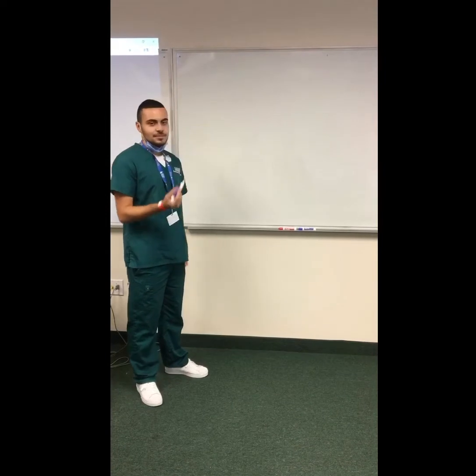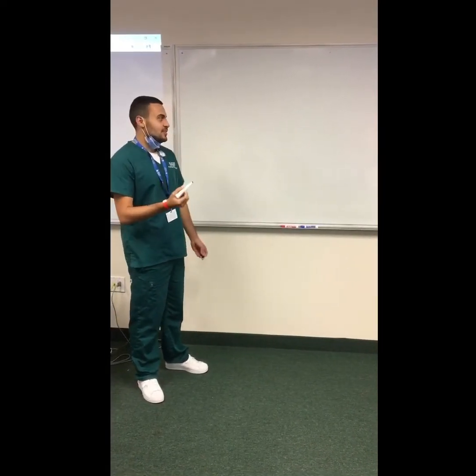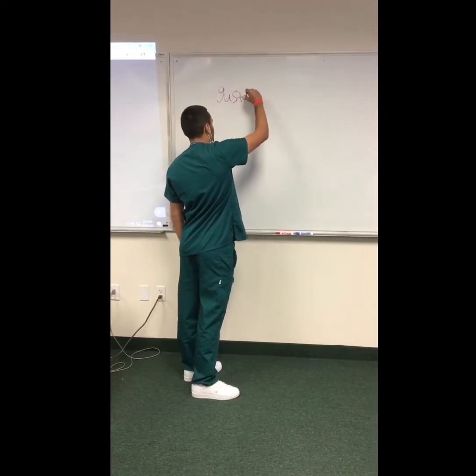My presentation is going to be about the grid. Grids are used to reduce scatter radiation. The person who invented the grid, his name is Gustav Bucky.